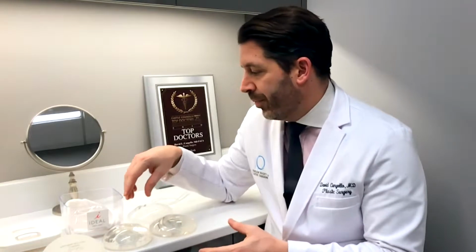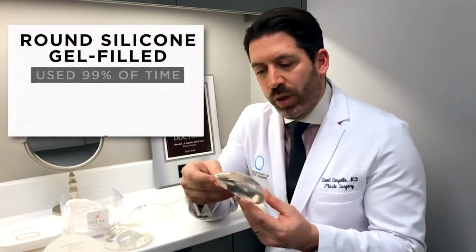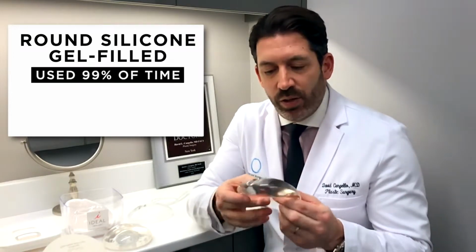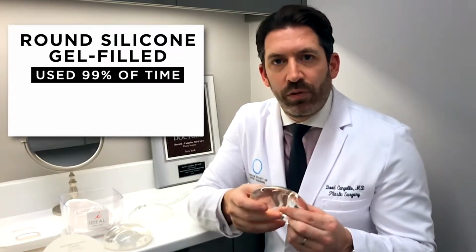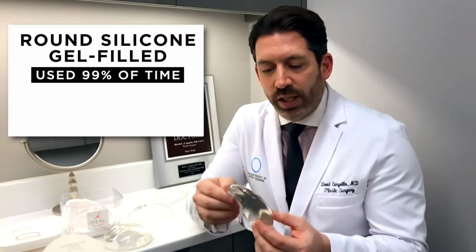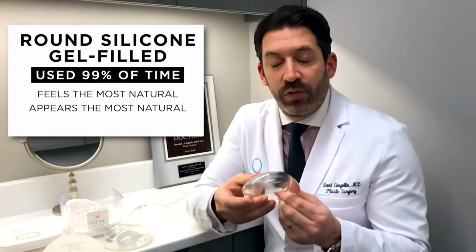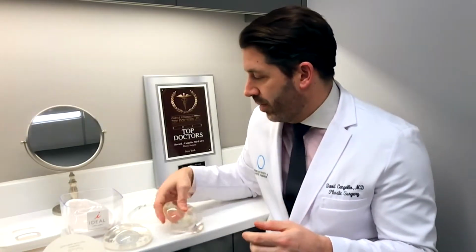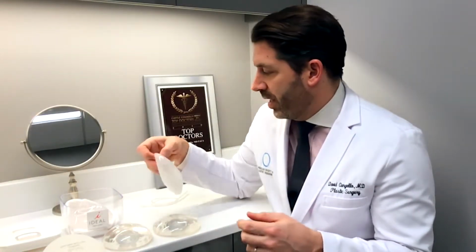here in this video. The first implant that I want to show you is the implant that I use 99% of the time in my practice. This is a round silicone gel-filled breast implant. The reason I like it the most is because I think it feels the most natural, and it appears the most natural.